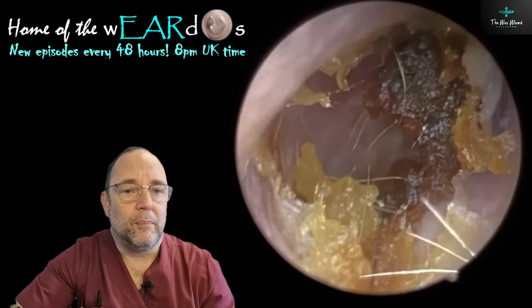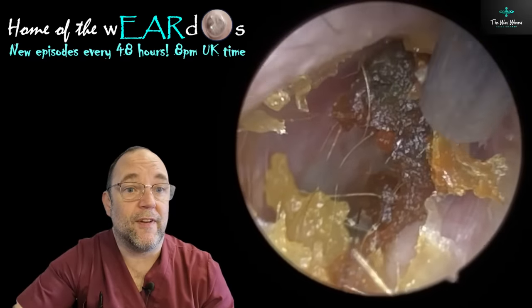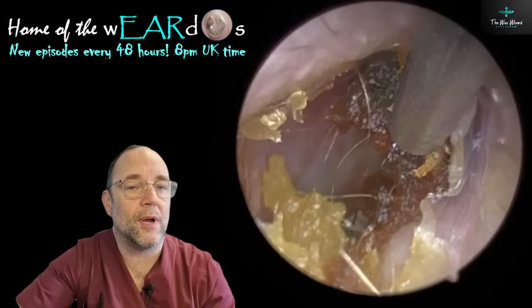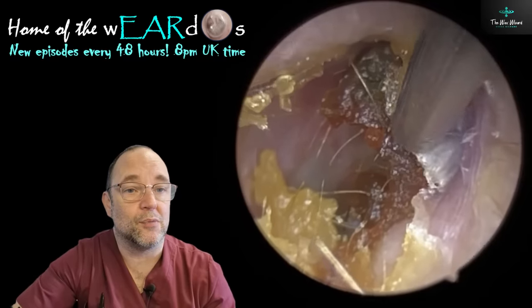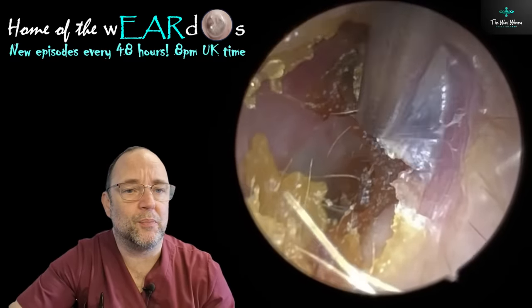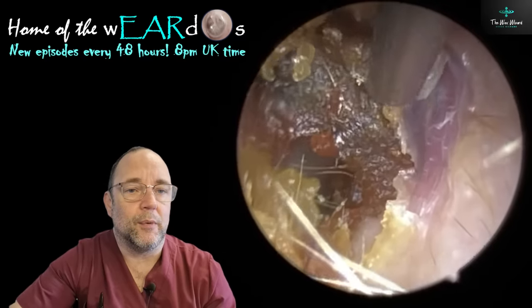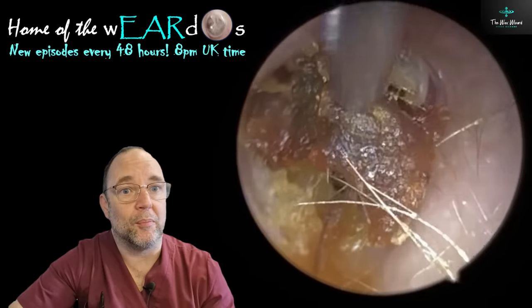It was a bit trickier than his wife's to remove this - obviously because it's a fair bit drier. I suspect they would have looked quite similar if he'd oiled it as well. I didn't get every little speck in this, but I didn't think it was important, to be honest. We were a little pushed for time, as I managed to squeeze this in at the end of her appointment.